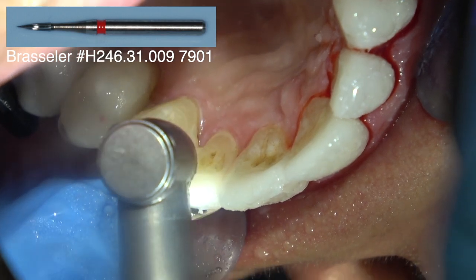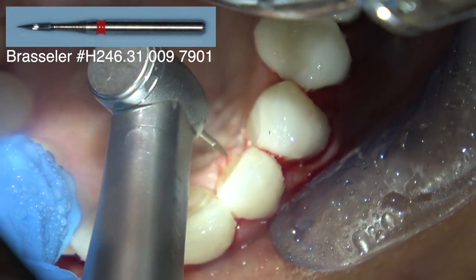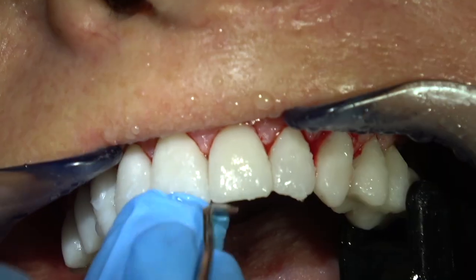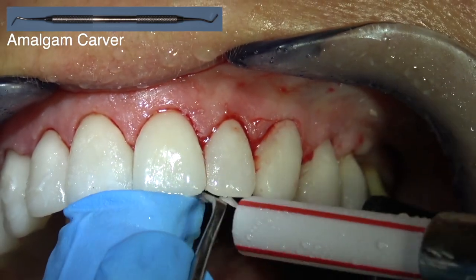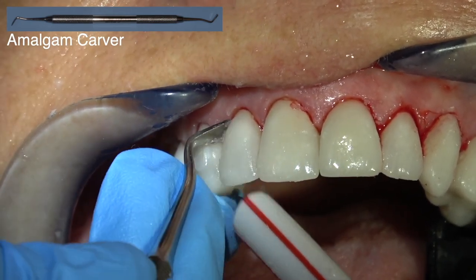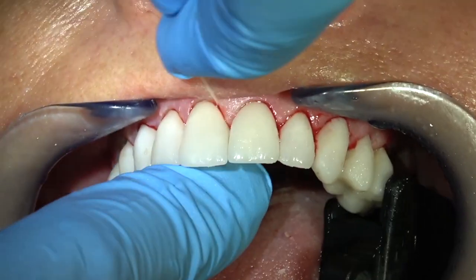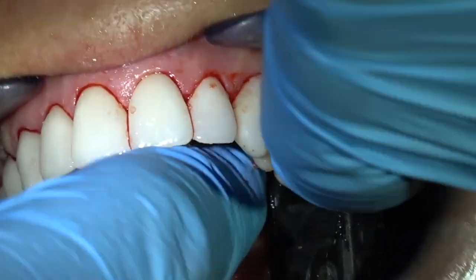That's why veneers are at least as expensive as a crown - the seating process is almost as time-consuming as the preparation, impression, and provisionalization. This is the flat end of an amalgam carver - great for removing any luting composite or adhesive off the facial surface of the restorations. It doesn't scratch or make a dark line on the veneers and cleans that off very nicely. Floss them again once they're set completely - you can put a knot in the floss and move it back and forth. Be sure you get any excess cement out from between the teeth.